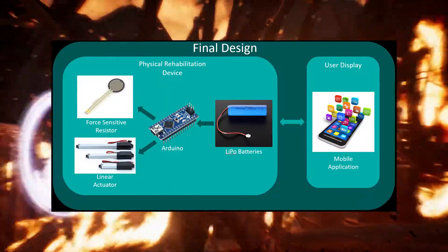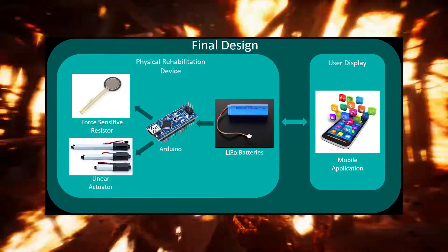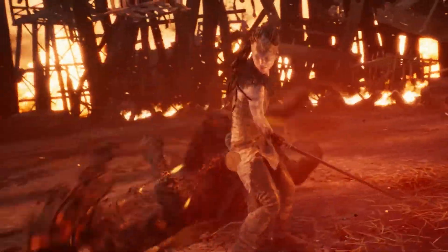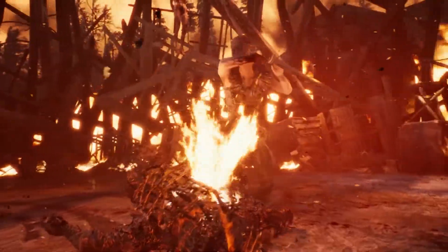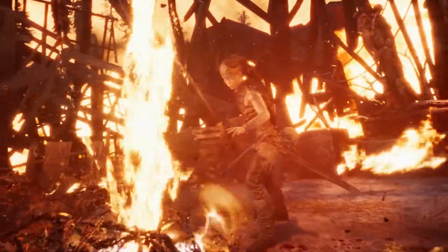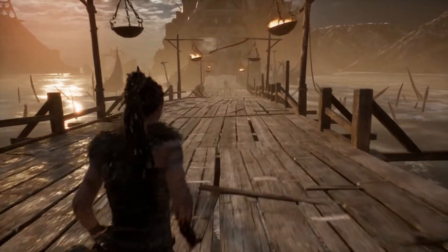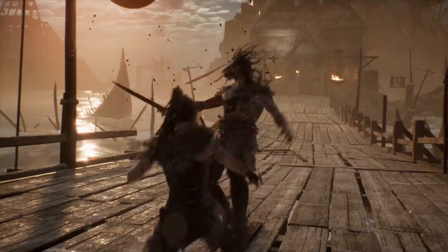Once I had settled on a final design and picked my hardware, I immediately began testing and proving the unknowns to identify any roadblocks ASAP. I knew an Arduino would work as a control system, I knew LiPos made a good power source, and I knew a force-sensitive resistor placed inside the glove would work — but I'd never used a linear actuator before. So I bought one, which was more than a broke student like me could afford, but luckily the uni paid for it. Then I plugged it in the wrong way around and fried it. After replacing it out of my own pocket, I got it working pretty easily.